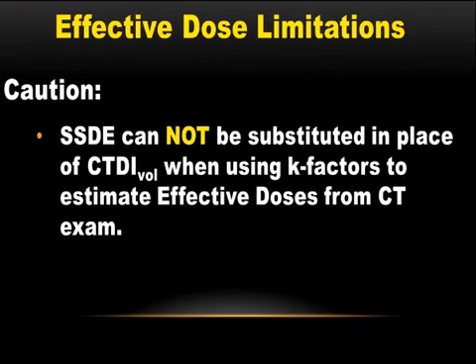Now, I made the comment with DLP that I can substitute SSDE for CTDIvol to come up with an SSDE-based DLP. Do not, in any situation, substitute SSDE for CTDIvol with the K factors that you may be used to using for estimating effective dose.